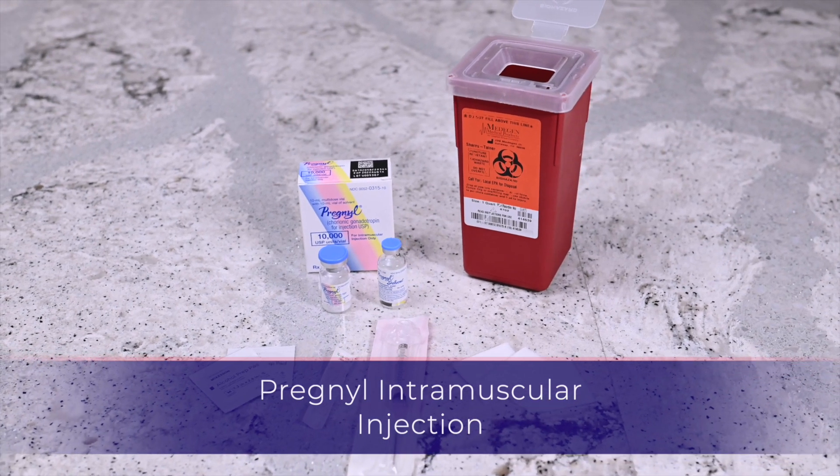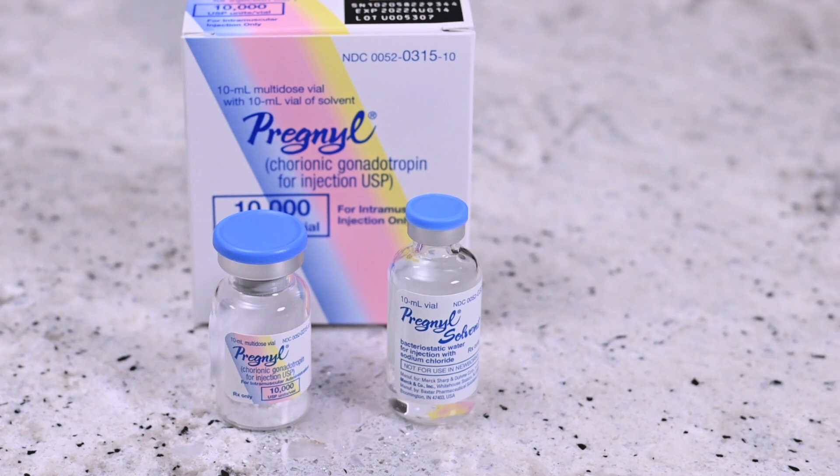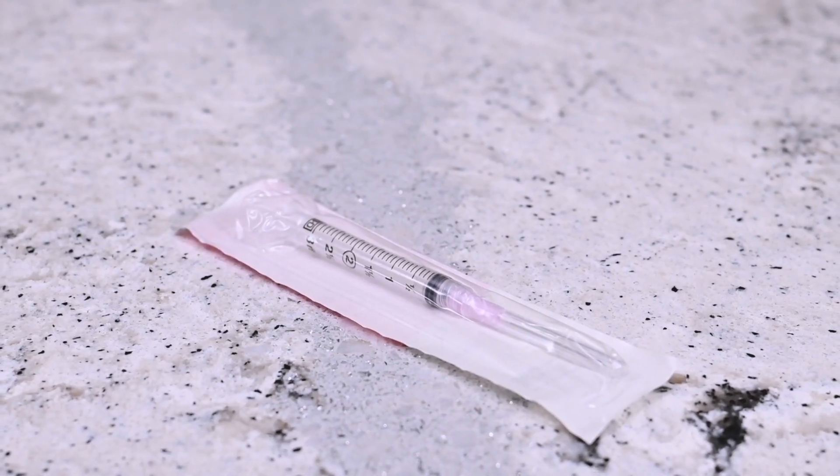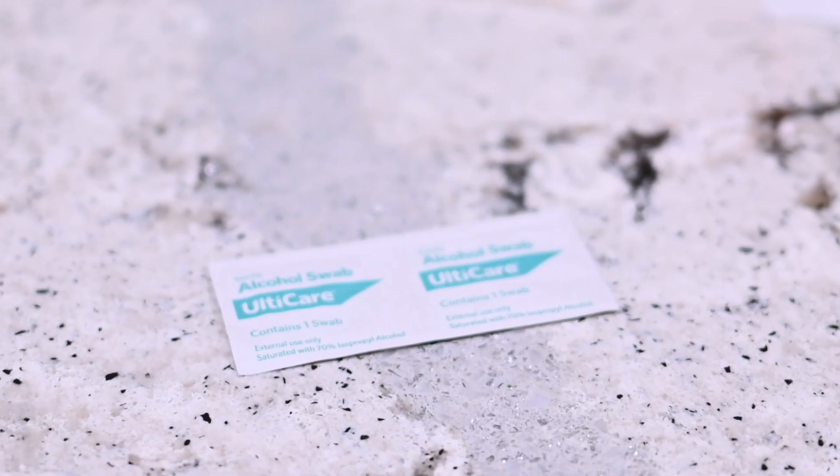You will need the following: vial of Pregnol powder, vial of Pregnol solvent, syringe with attached needle, 23 gauge intramuscular needle, alcohol prep wipes, gauze, and a sharps container.